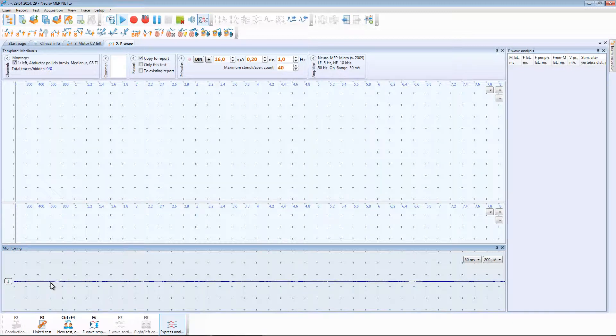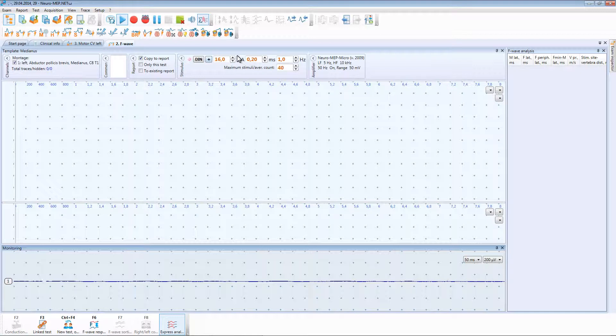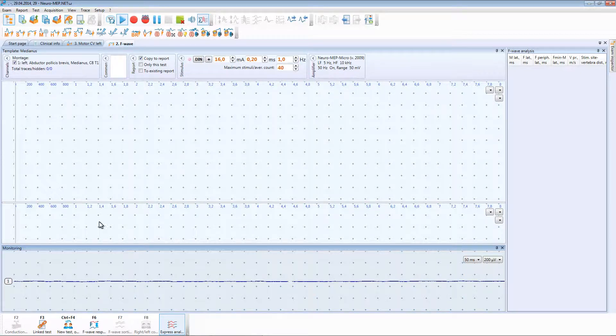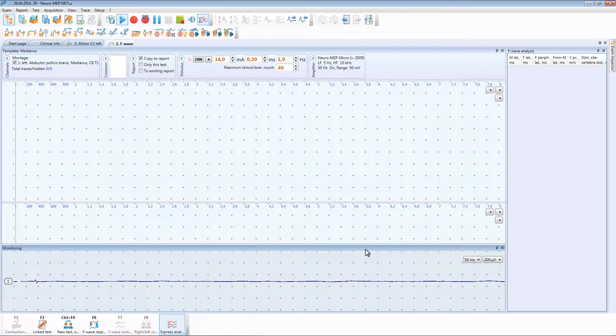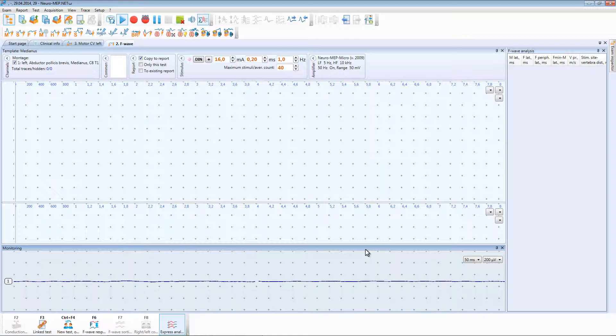The latter value of stimulating current is saved. Monitoring mode in this test activates automatically. The studied muscle for this test should be relaxed. It is very important.